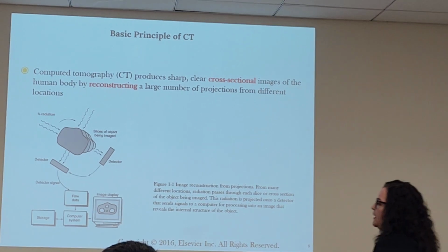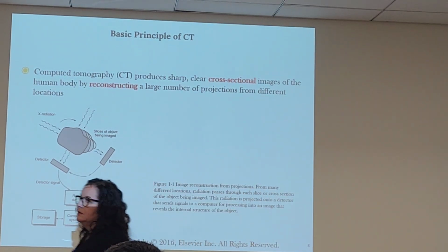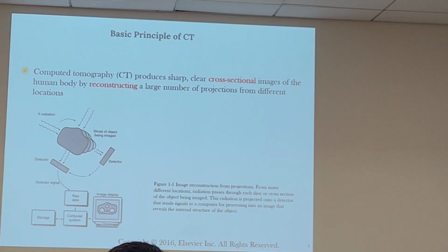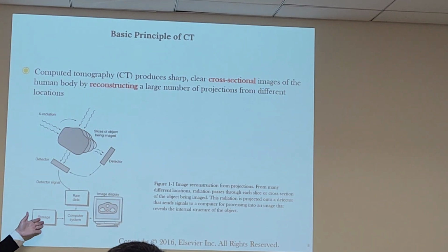And so now we're talking about, well, how does CT work? Well, we've got to say, oh, it's a three-step process. We know how it originated, and there's a lot more behind that, you're going to see that in the videos. But for here, you're going to walk away and say, I know who Hounsfield is because there is a measurement after him. When we start talking about Hounsfield units, now we know who Hounsfield is, right?